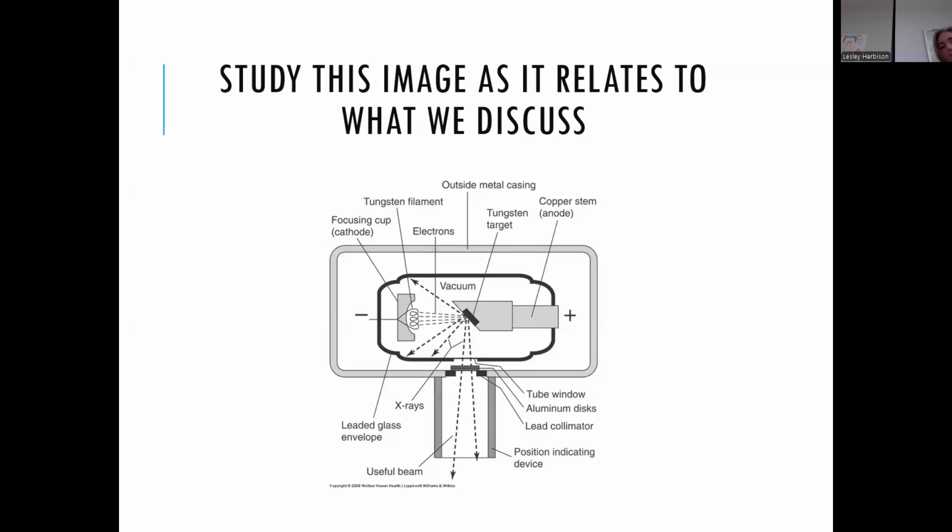And let's get familiar with the inside of the tube head. And I know there is an image that's similar but different that you're probably looking at on slide 7. So I don't want that to be confusing because they're actually two different parts that are in that picture on the PowerPoint.